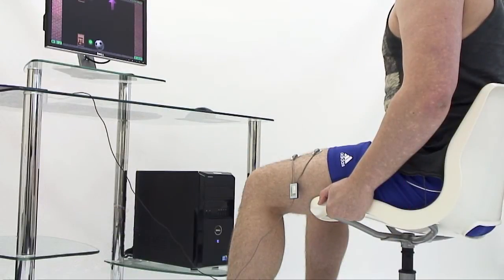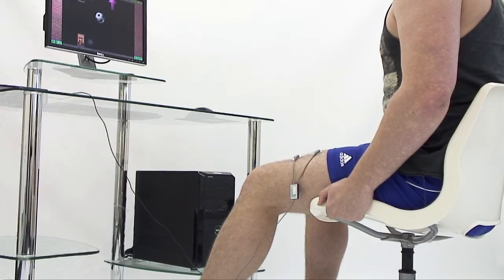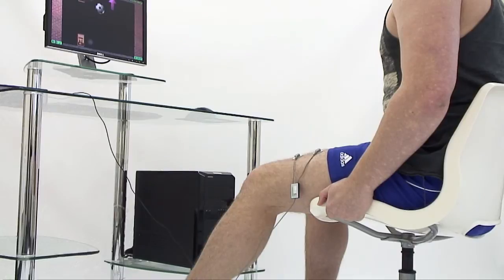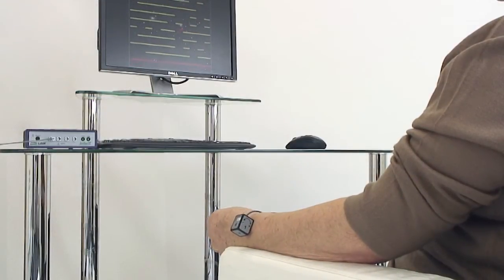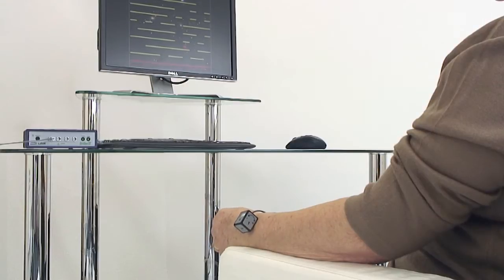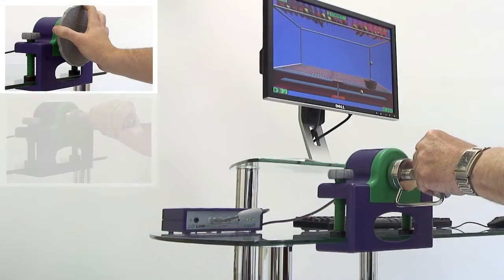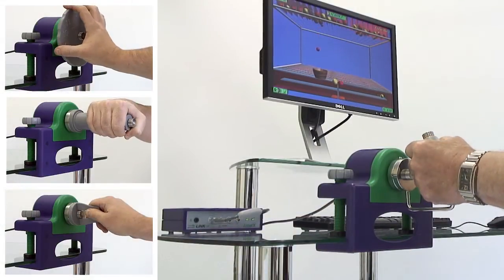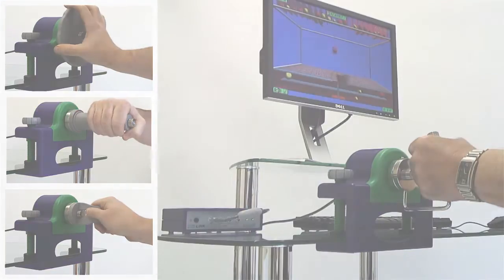This in turn encourages the patient to focus on a smooth, efficient and coordinated movement in order to achieve good motor control. In cases where there is some joint movement, the AngleX and upper limb exerciser help progress the patient along the rehab pathway. Active movement against gravity is initially promoted, and then resistive functional movement can be encouraged to realize muscle strengthening goals.